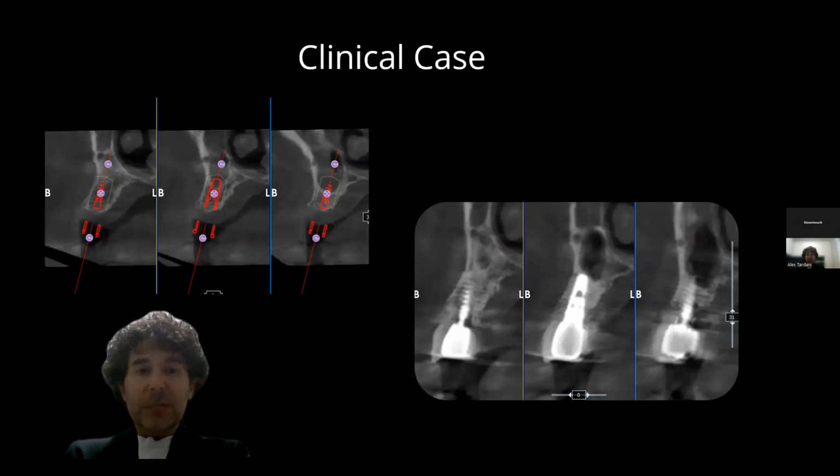So, returning to the advantage of using the mallet, we can see there is a thickening of the buccal cortical plate, which is always desirable in implant placement cases, because we know that maintaining a buccal cortical plate thickness of about 2 millimeters is one of the things that ensures the long-term success of our implant. And at the same time, we can see how the approximately 3 millimeters of lift we wanted to achieve have been performed perfectly. The entire apex is perfectly integrated, and there is no visible difference in trabeculation between the native and the grafted bone.